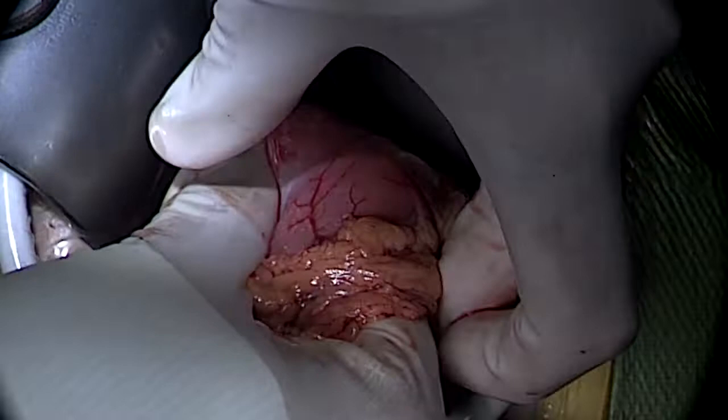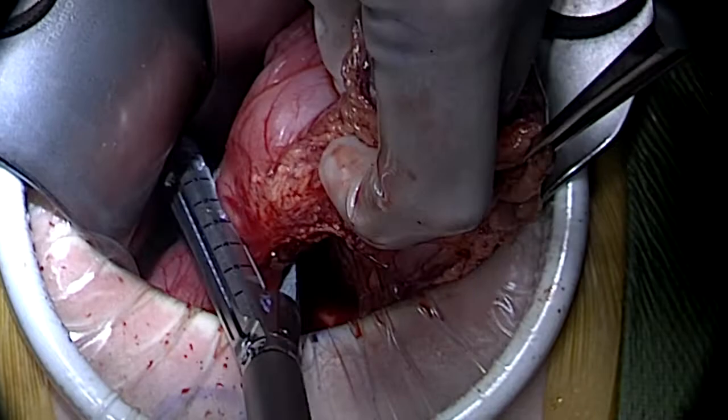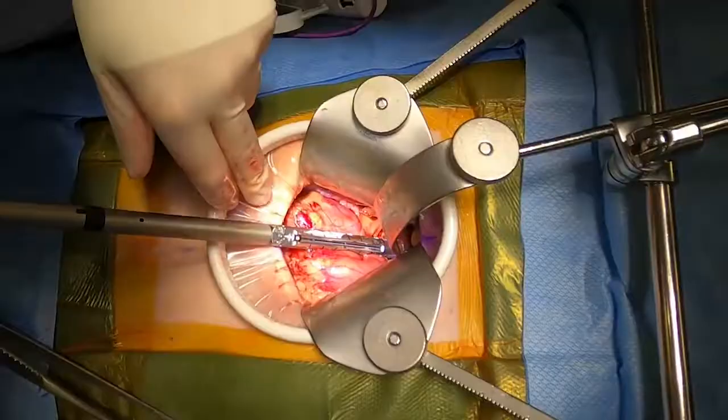The next step for the operation is the transection of the duodenum. This is done just distal to the pylorus, utilizing a reinforced staple load.